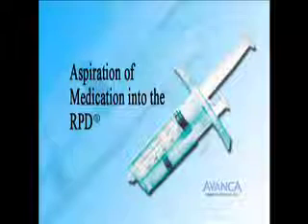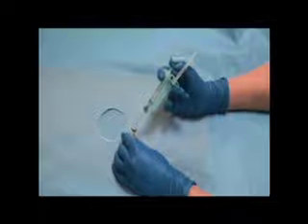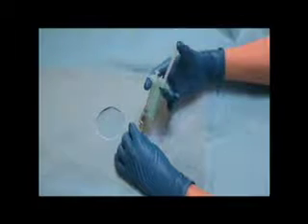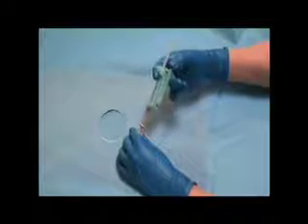Aspiration of medication into the RPD. The RPD can be held like a conventional syringe. The needle punctures the stopper of the desired vial. The aspiration plunger is depressed, and the RPD fills with the drug.